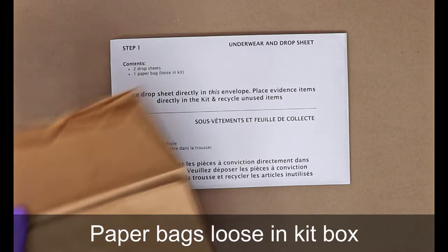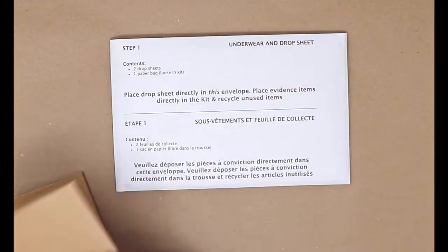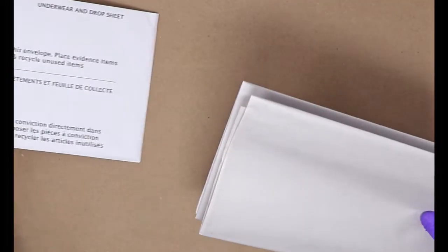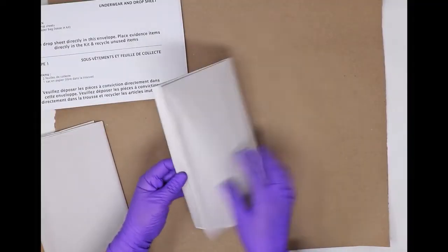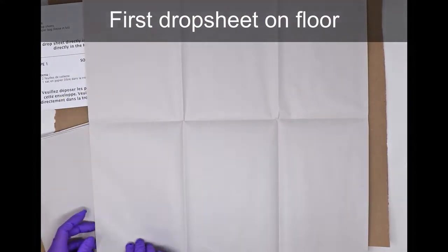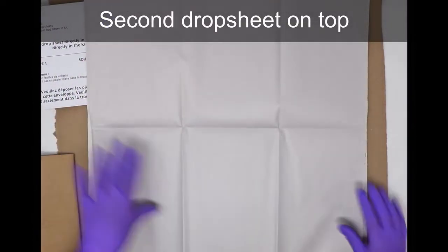Paper bags can be found loose within the kit. If additional paper bags are required for additional items of clothing, they can be found within the auxiliary pack. The Step 1 envelope itself contains 2 drop sheets. One drop sheet is fully opened and placed on the floor. This is to protect the upper drop sheet from contamination. The second drop sheet, again, is fully opened and placed on top of the first. The patient will stand on top of the upper drop sheet and remove clothing.